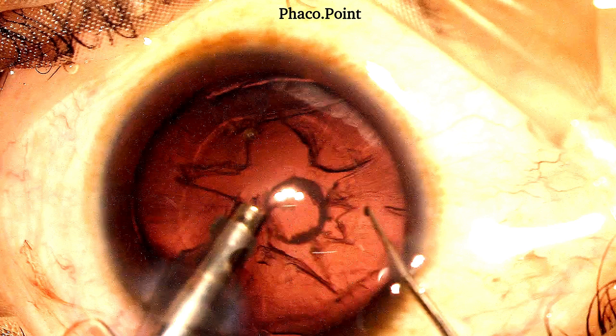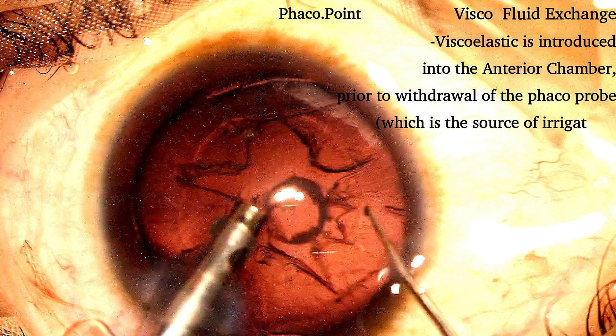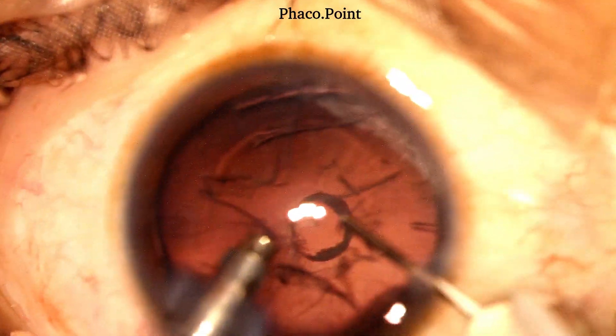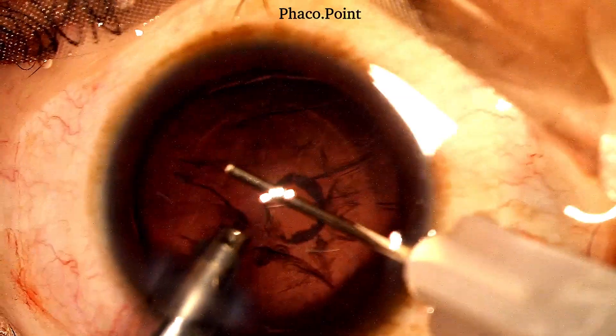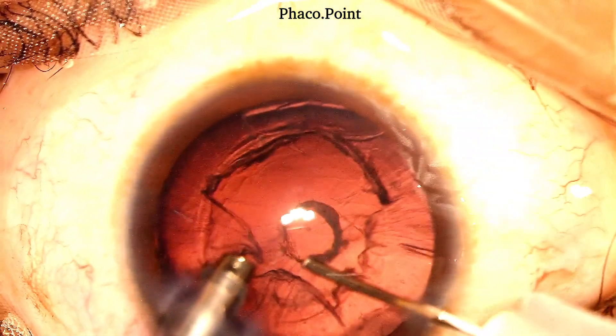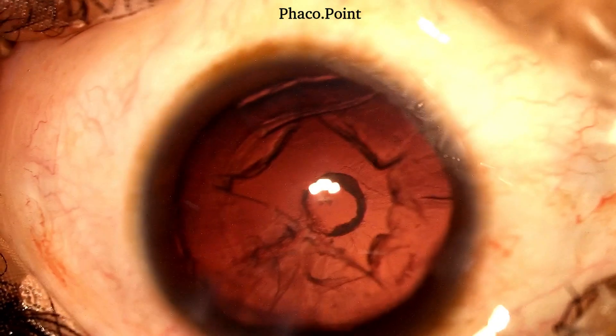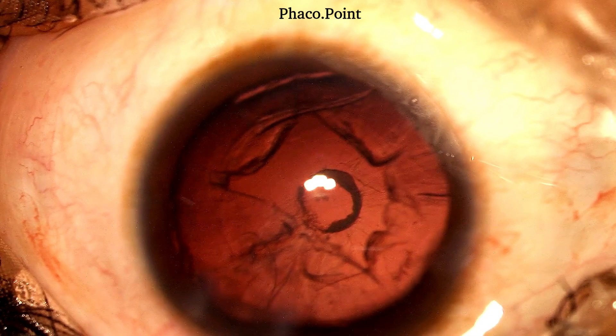The next step is of crucial importance — the visco-fluid exchange. When the source of fluid, in this case the phaco probe, is removed out of the eye, the chamber is going to shallow. So prior to removing the phaco probe, it is important to introduce the viscoelastic with the non-dominant hand. Once the entire anterior chamber is filled with viscoelastic, the phaco probe is then withdrawn from the eye. As a result, there has been no shallowing of the anterior chamber and no anterior displacement of the posterior capsule.